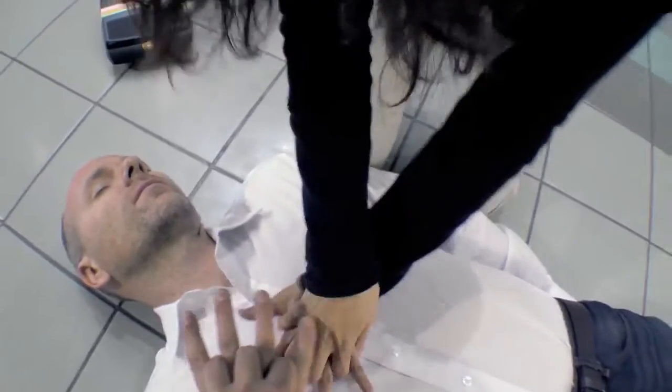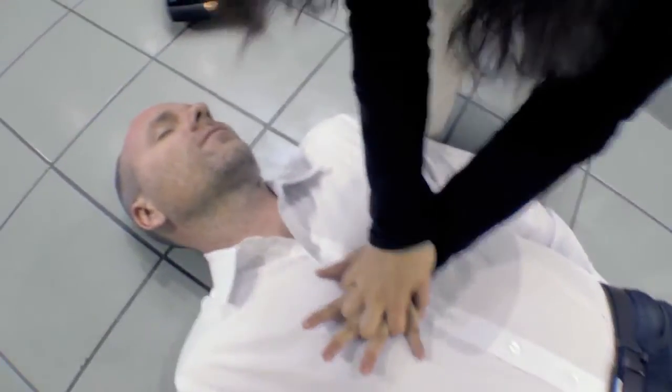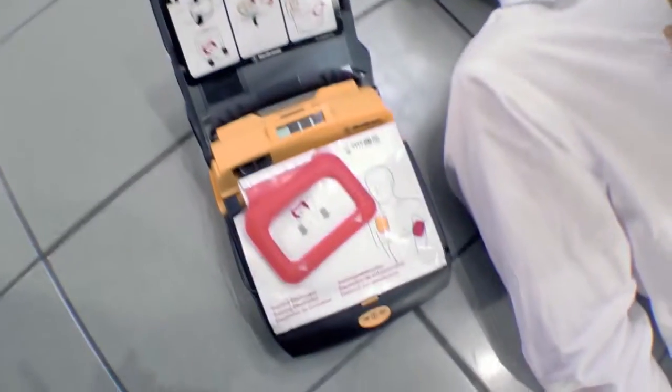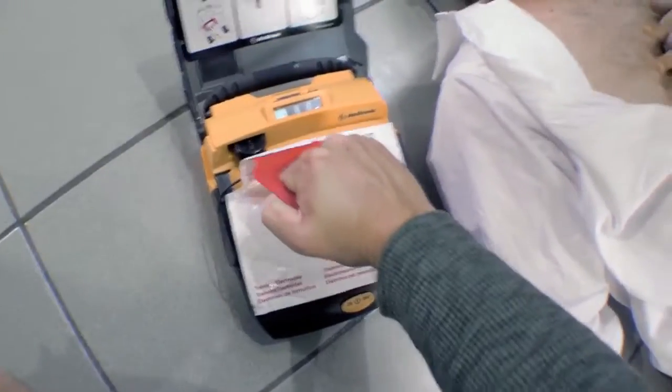I'll take over. You get the AED ready. Call for help now. Remove all clothing from patient's chest. Pull red handle to open bag.